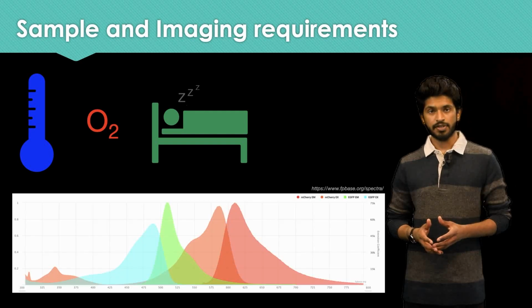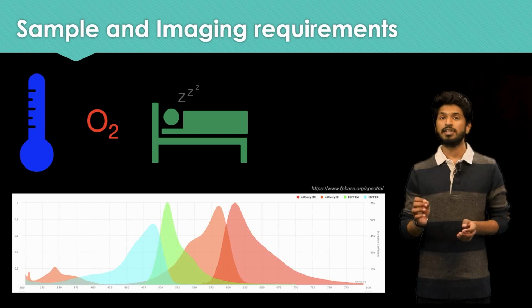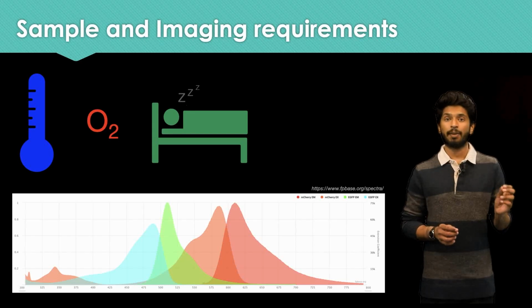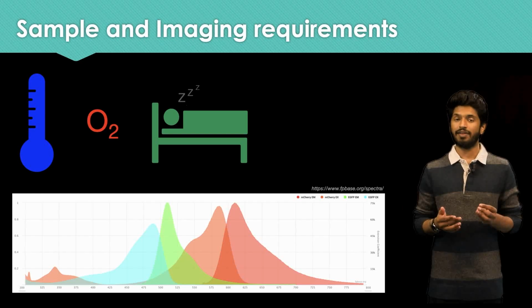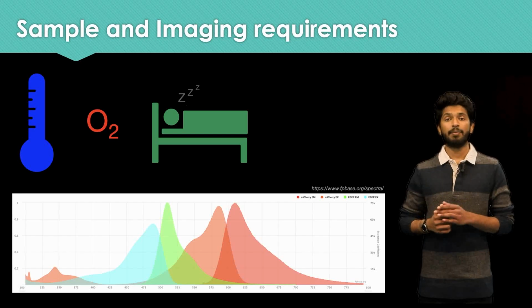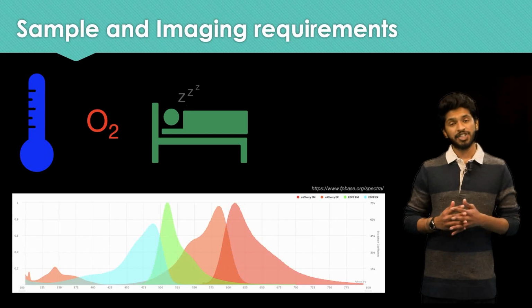With the setup used, we could image multiple components with different fluorophores simultaneously, but it is important to use emission wavelengths which do not overlap to image them separately. For example, GFP and mCherry are commonly used together as their emission wavelengths do not overlap. The microscopes should also be capable of detecting different fluorophores at the same time with multiple detectors and channels.